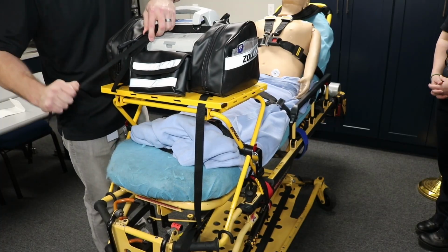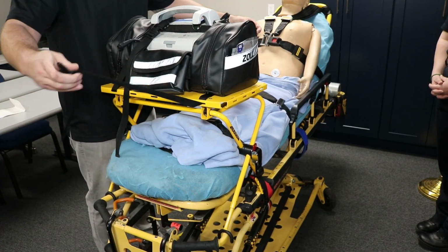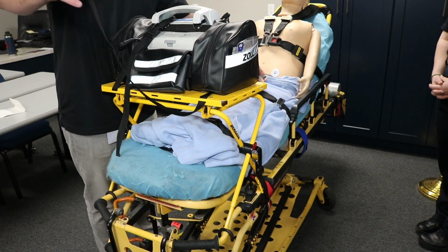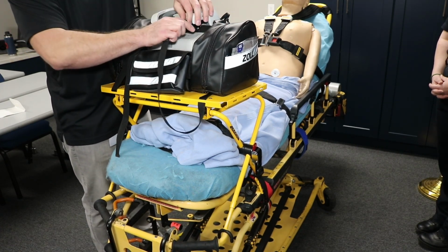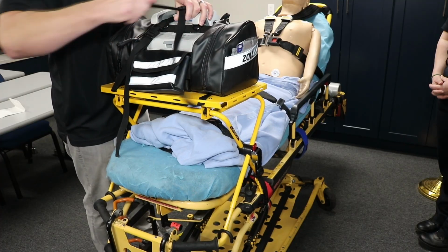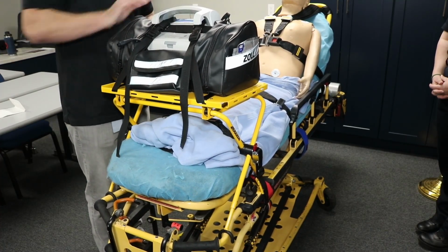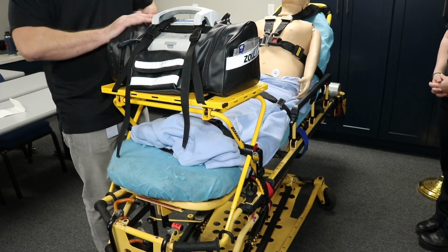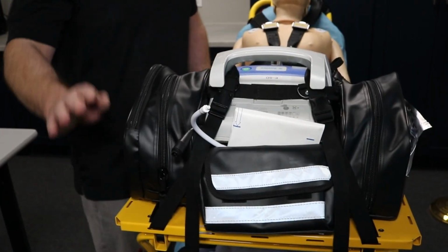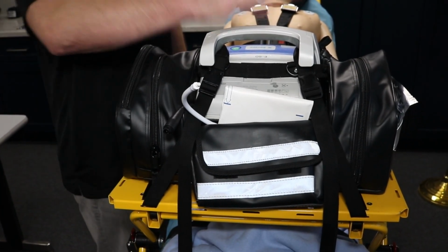This will come through here. Make sure we cinch it down, make sure it's nice and secure. We're going to do the same thing on this side. Remember not to go over the saddlebag, but through the handle here. And securing, give it a little tug, make sure it's not going to fly off, land on the patient's lap or on the ground.